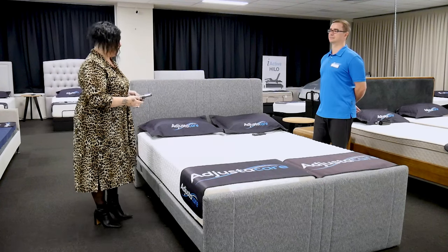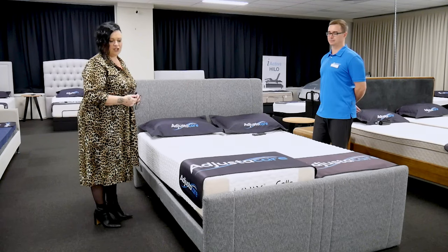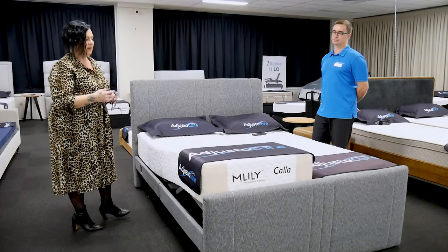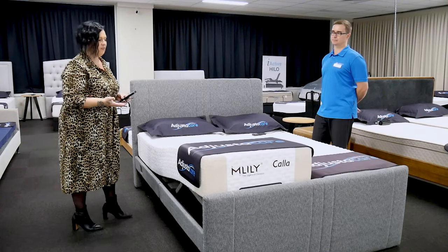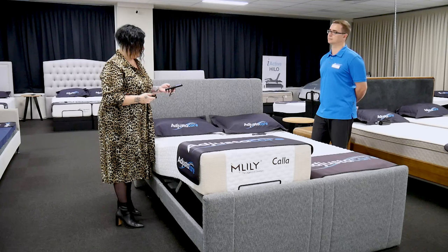The Easy Flex is a combination of two adjustable beds in one. It comes as a complete unit with two different fabric choices. It gives people the option that if one person needs to elevate their feet through the night or raise their head, they can do that independently from their partner in the bed next to them.